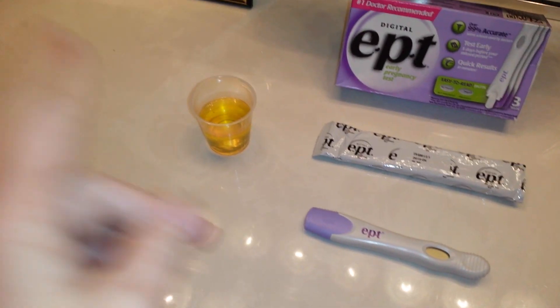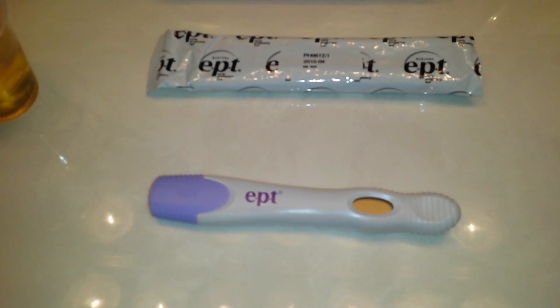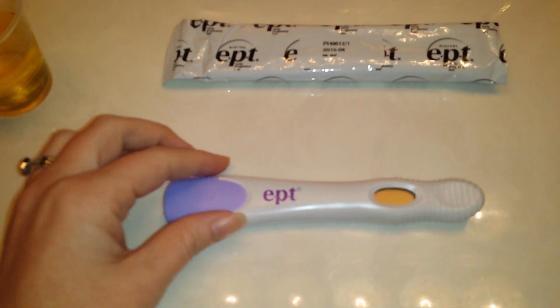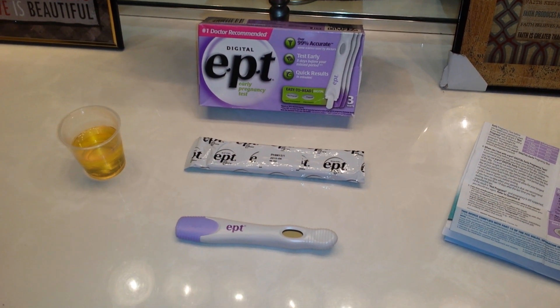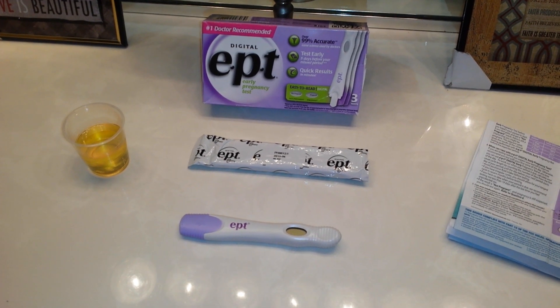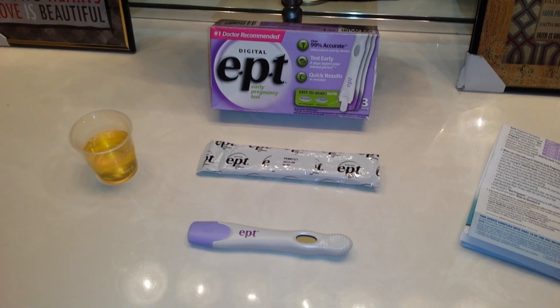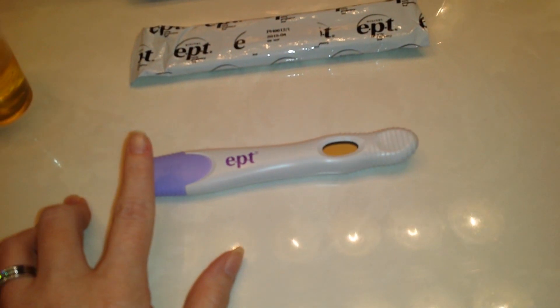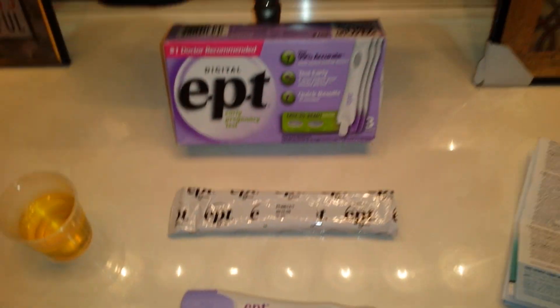I opted to collect a highly concentrated sample. If you're dipping it in a cup, you want to dip it for precisely 20 seconds — and I mean precisely, otherwise you will get an error. The last time I did this I went maybe three to four seconds longer and it caused an error. With the second test I dipped precisely 20 seconds and it worked fine. If you're doing a midstream, hold it in your urine stream for precisely five seconds, then immediately lay it flat just like this.